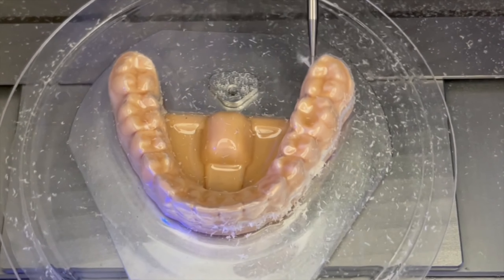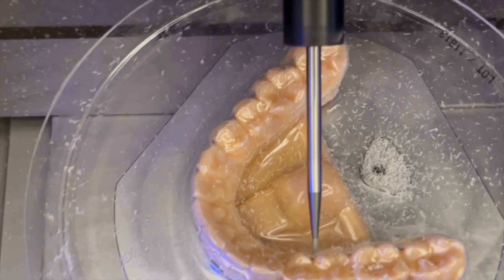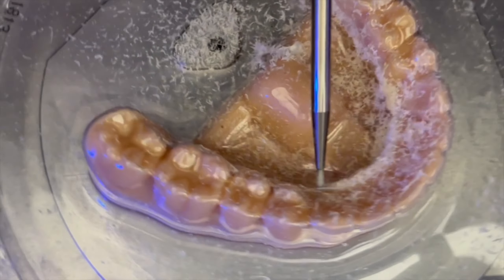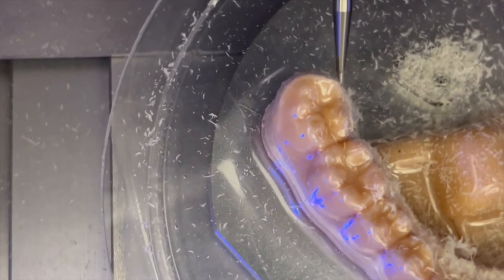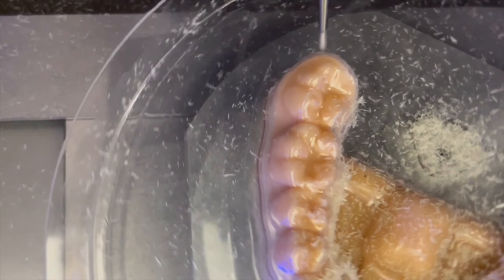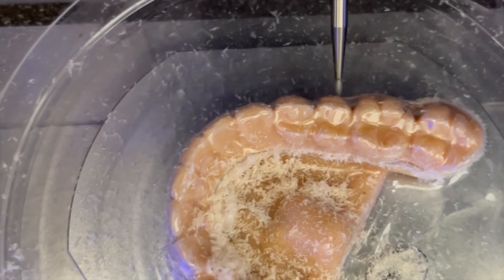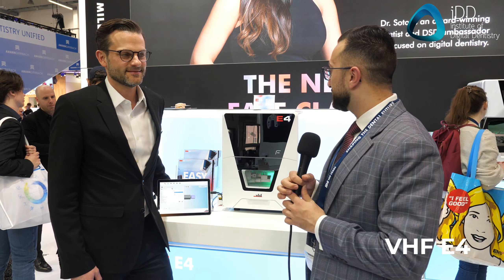I have to speak quickly because it takes literally less than one minute to trim that aligner. After referencing the axis, the tool will come from the top — it's one tool — and it will just follow the trim line that was previously determined by the CAM software. You can see how the tool actually goes around the trim line. For this case, it takes about 40 to 45 seconds, and you have a very, very nice margin line.